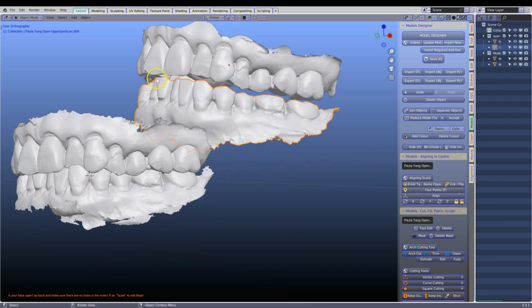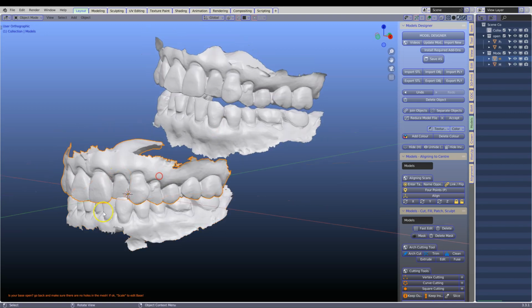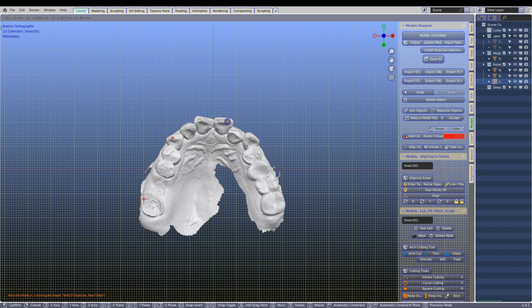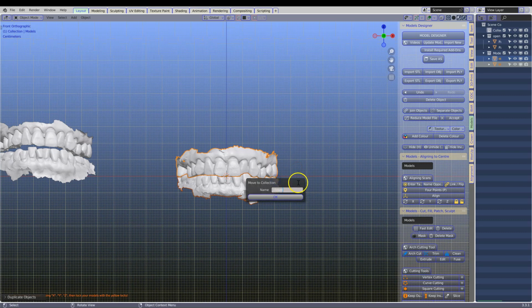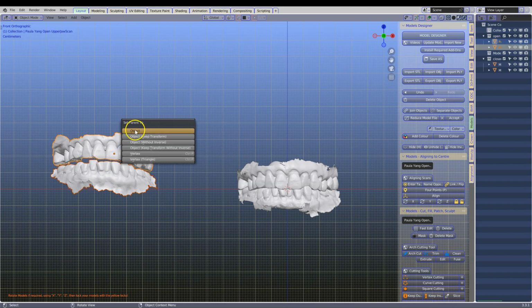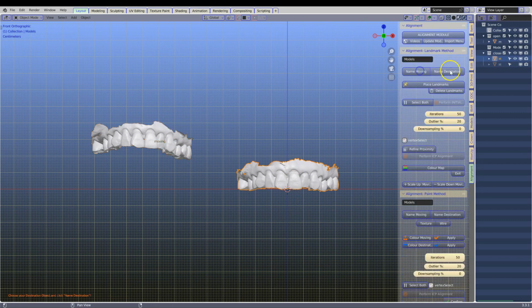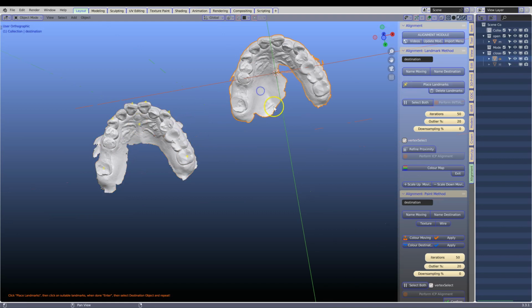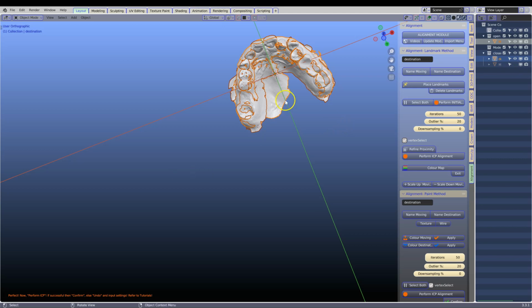Here we're going to be opening up the occlusion using the patient's own occlusal surfaces. The first thing we're going to do is align the closed occlusion to the center of Blender. We're going to put this into a different collection. I'm going to parent the lower one to the upper one, Control P to parent, and then we're going to use the ICP alignment module to align the upper with the open occlusion to the upper with the closed occlusion.